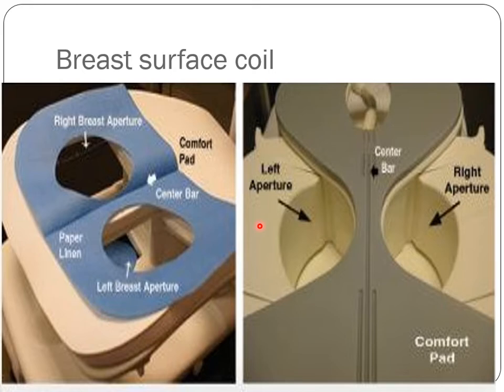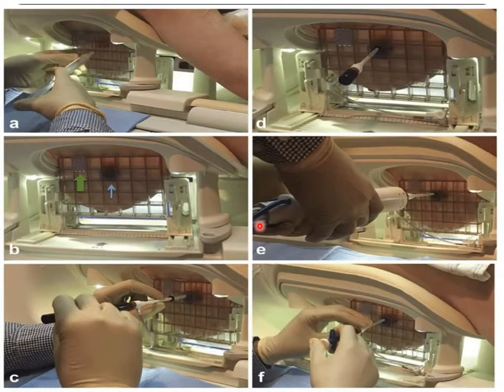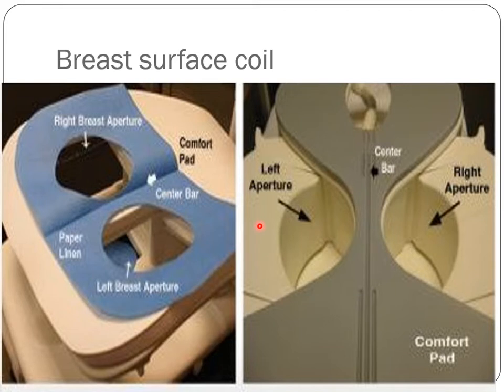And the increased number of channels helps get slightly faster images. It's not that much difference, but more channels, a little bit faster speed. And the other thing that every one of you needs to know: you cannot have a 16 channel coil where your MRI machine is 4 channel.